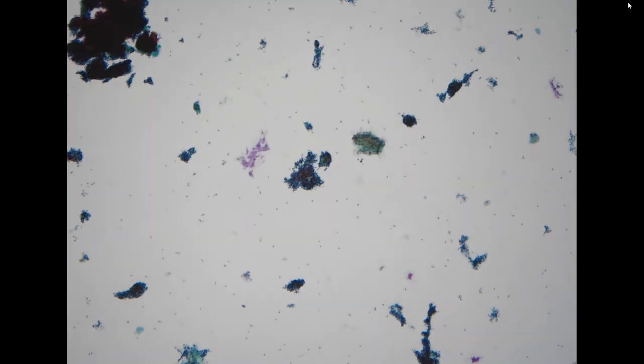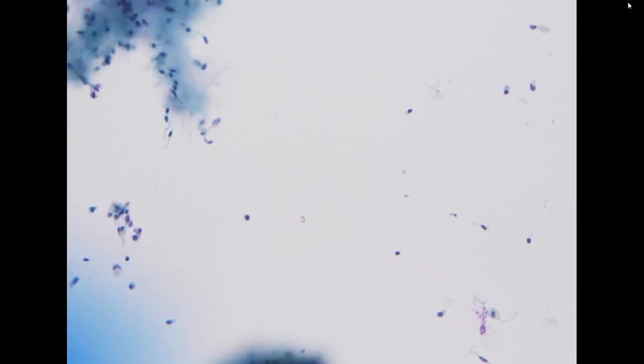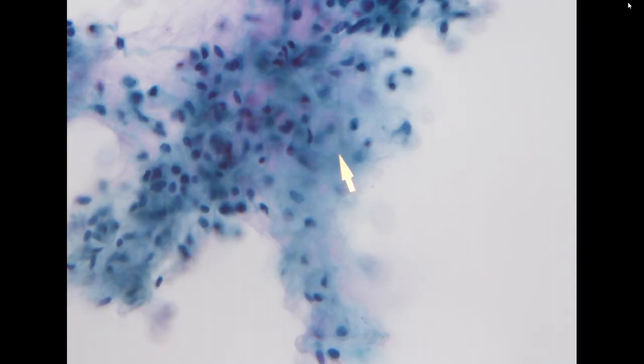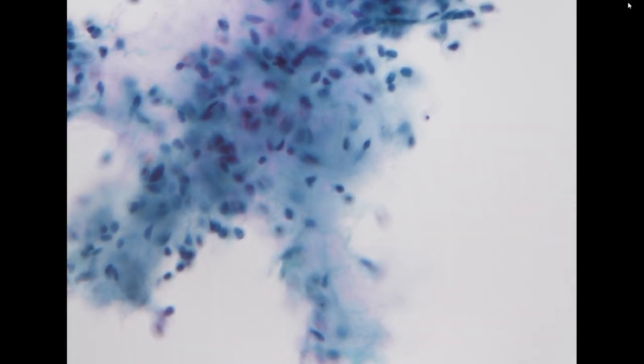If we are thinking of pleomorphic adenoma, we will go ahead and check if there is any chondromyxoid matrix material. Here we find some grayish-looking material in the background. In the Papanicolaou stain, the extracellular material will look like this, and you always have these fibrillary edges, so you cannot draw a line at the edge because it's very fibrillary.